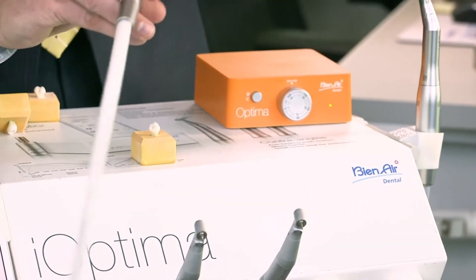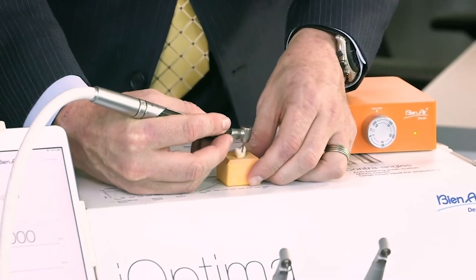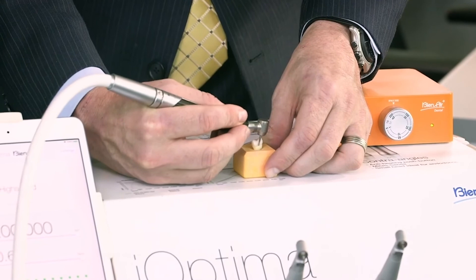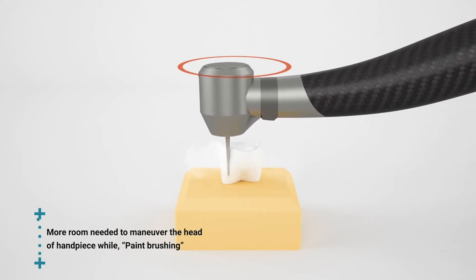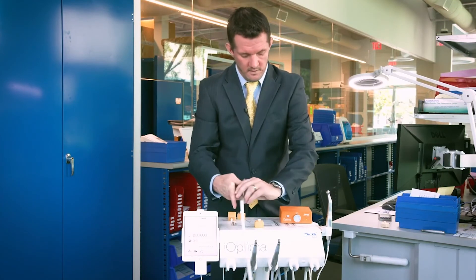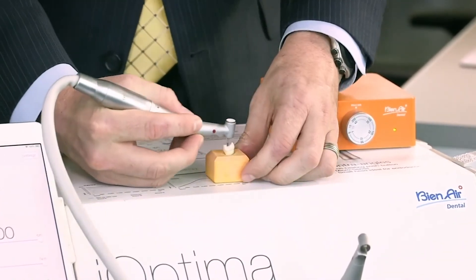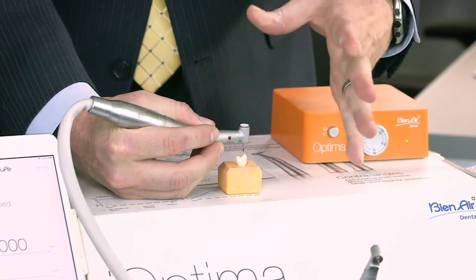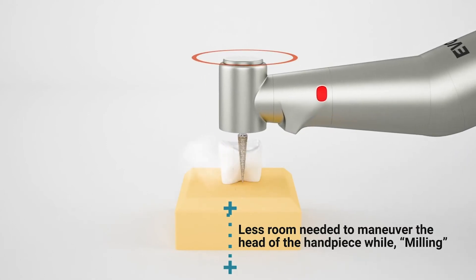If you use an air driven hand piece with a paint brushing technique, the first thing you notice is that you need a lot of space to maneuver. So if you're in the posterior of the mouth and you have to drag the burr across the tooth surface over and over repetitively, you need a lot of room — therefore dentists gravitate towards small heads. But with an electric, if you observe the milling technique, even in the posterior of the mouth, you're able to get into tighter areas. You can get in and let the burr do the cutting, and you'll notice the hand piece hasn't moved all that much, so you don't require as much room.